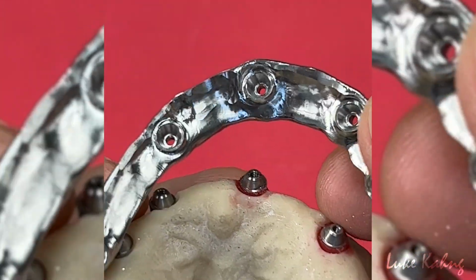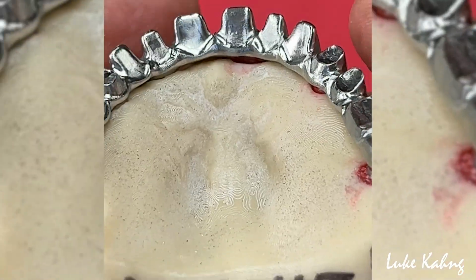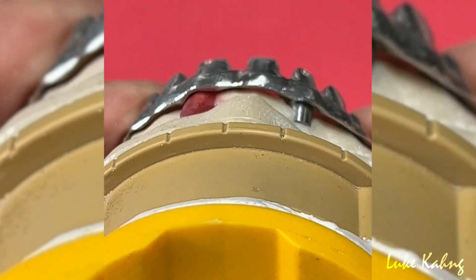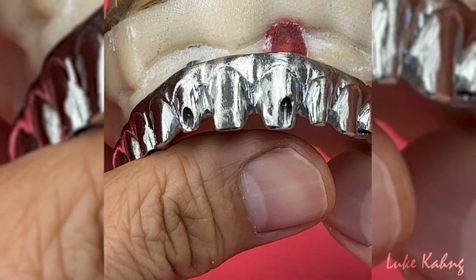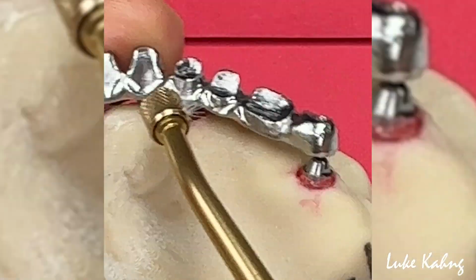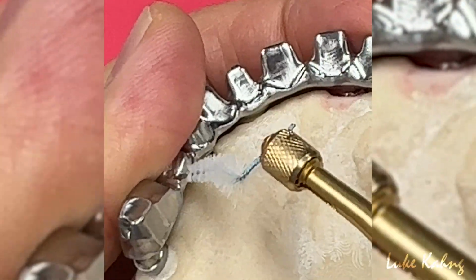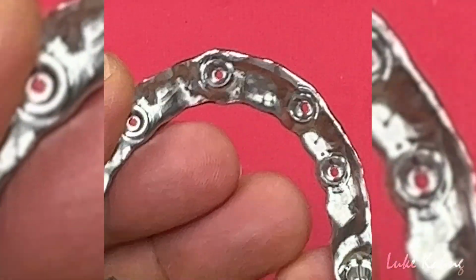Yes, it was a hygiene problem, so we're going to open all underneath, which is what the patient wants. Here is all open, so it will be metal underneath, no touching, trying to avoid any closed area. So another unique case, and also two single implants. Separate crowns, so all the space is cleaner. That's what patients want. So it will be all open underneath. I'm trying to concentrate on the facial too. All right.